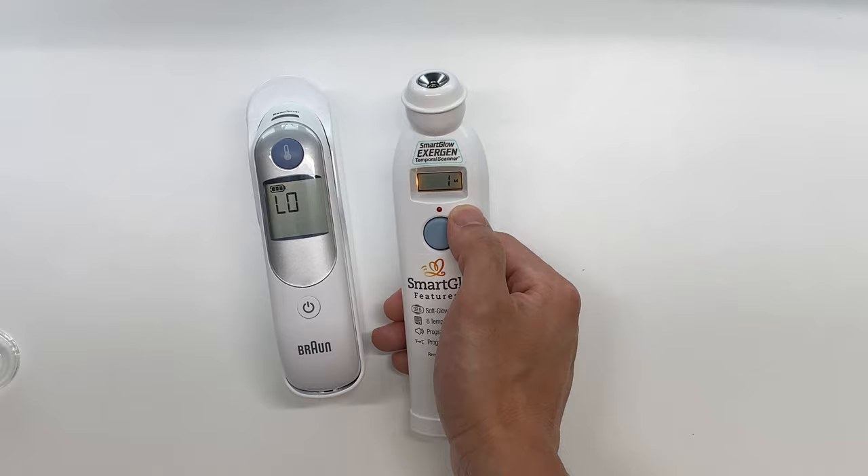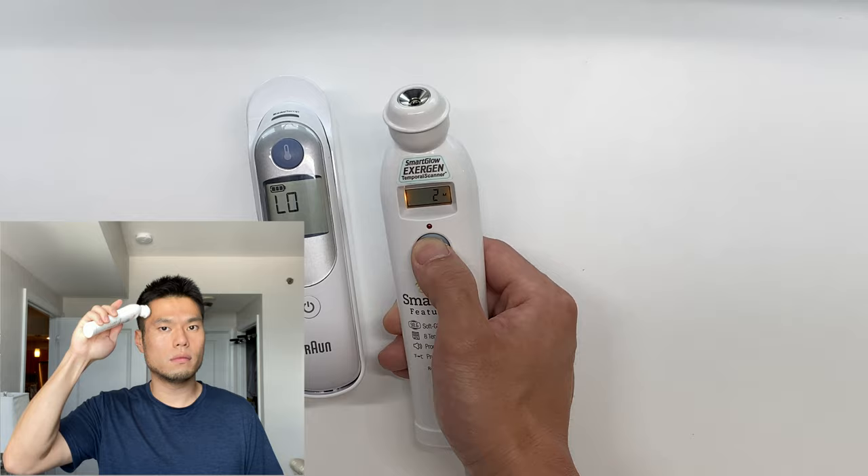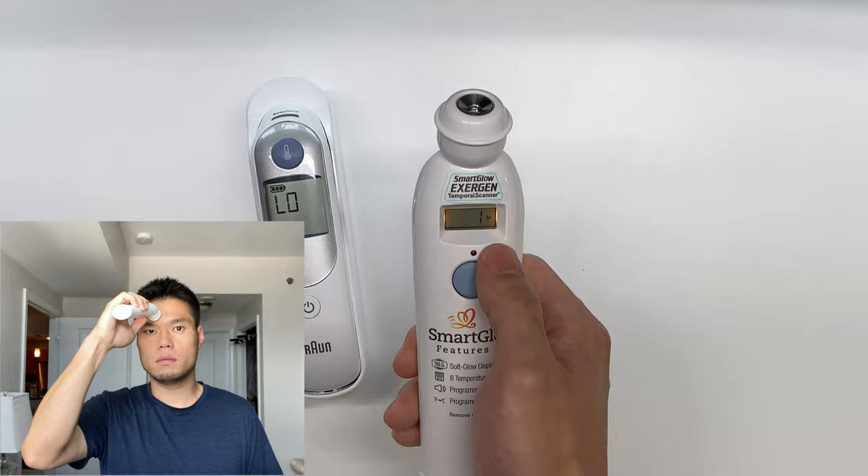While this is depressed onto your forehead, we press in on the button, and while that button is pressed in we slide it across to our hairline, then we let go, and that will give us our temperature reading on the display.